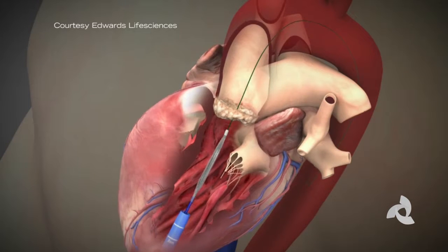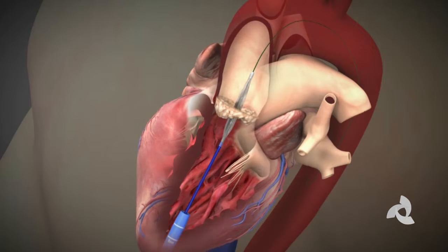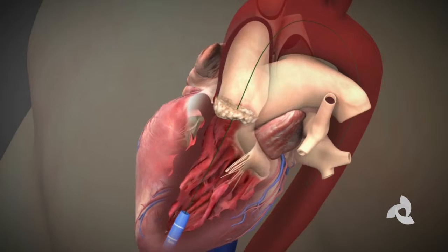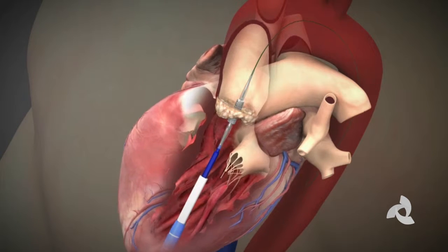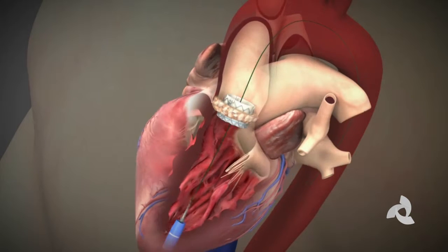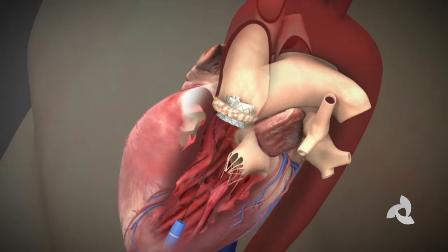In terms of what the TAVR is, we basically use a balloon to open up the valve initially, and then this is a stent with a valve sewn inside it. And it's the same sort of valve that's used in surgical valve replacements. It's a cow pericardial valve that's created inside the stent, and the balloon is inflated across the aortic valve, and the stent is deposited in the annulus and pushed back into the annulus, and that's where it's anchored. And once it's in, it's rigid. It's in there. It's not going to move.